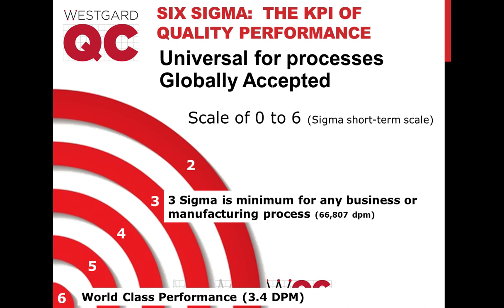But let's take the broader idea of, I have an assay, it's not great, what am I going to do with that? If switching is not an option, if you've tried ways to improve the imprecision, you've tried ways to reduce the bias, and you still have a low Sigma metric, then one of the things you can do is employ what's called a reference change value, RCV. Sometimes it's called a critical difference. The person who has popularized it the most was Callum Fraser. You can find a lot of details about this on our website and in the scientific literature.